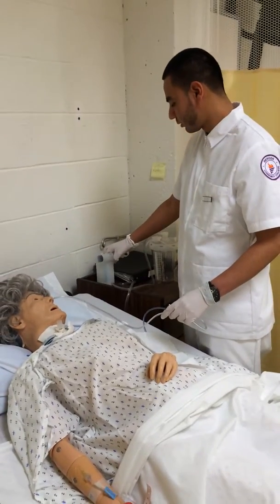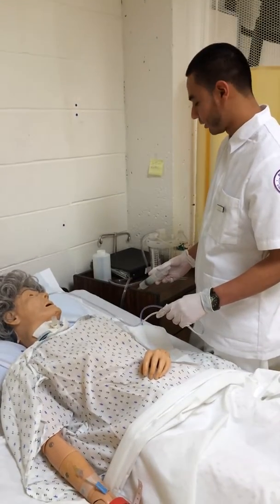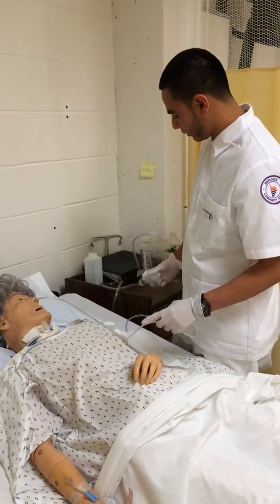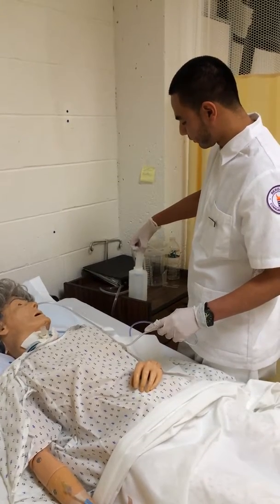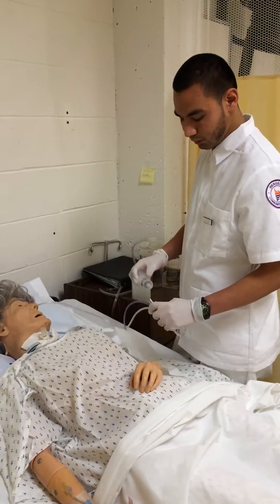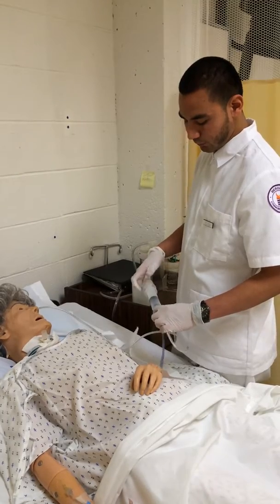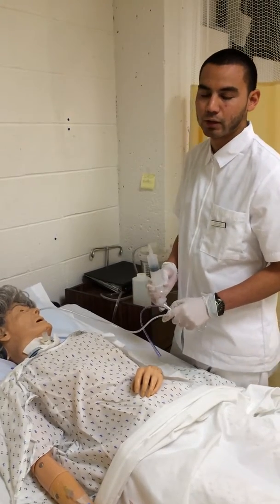The fluids that you get, you want to put on your litmus paper, just to check for pH, and make sure it's below 4. After this, you need to get about 20 ml of normal saline and flush the tubing. Then aspirate again, and assess the fluid for color and odor.